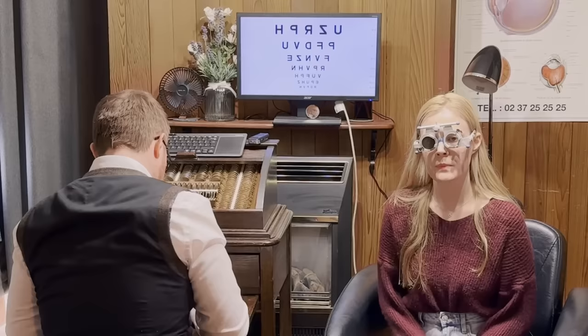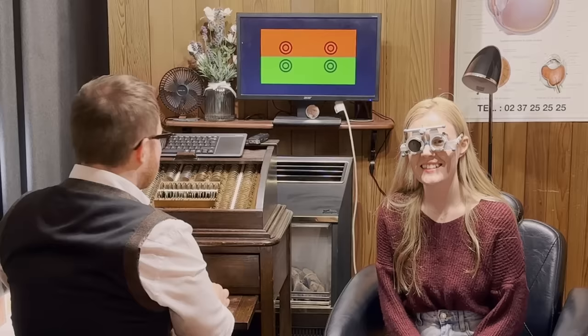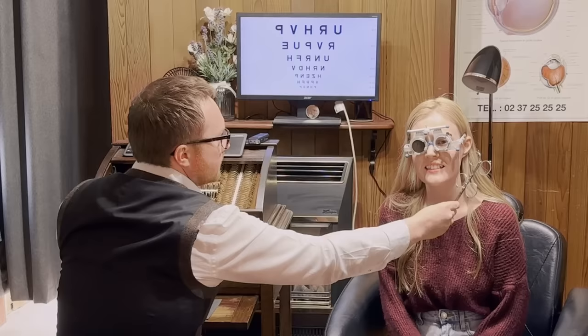Okay. And if we go back to the circles on the red and the green now, do they look rounder, sharper on the red, the green, or are they pretty similar? Still the red. Okay. If I put this one in front. Oh, they're the same with this one, yeah. Just going back to looking at the bottom line of letters, is there much difference with that? Or is it just a bit smaller and blacker, do you think? Smaller and blacker, so, yeah. It's more bold. Okay, that's fine.